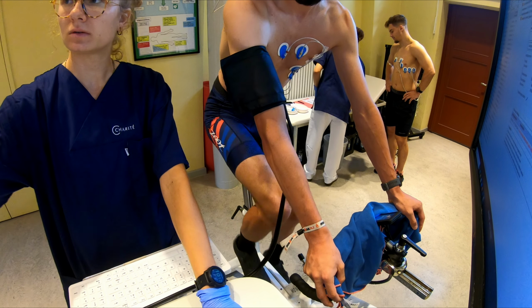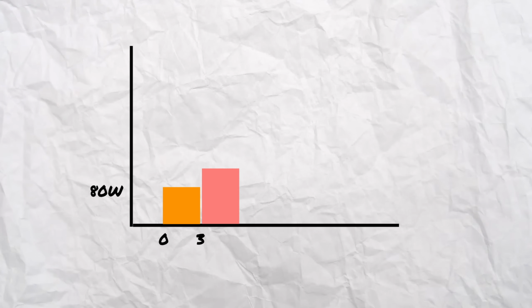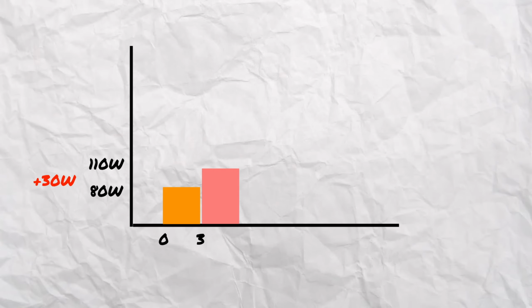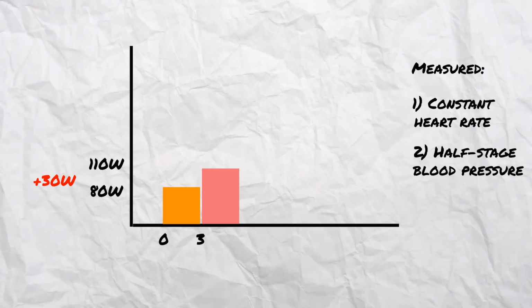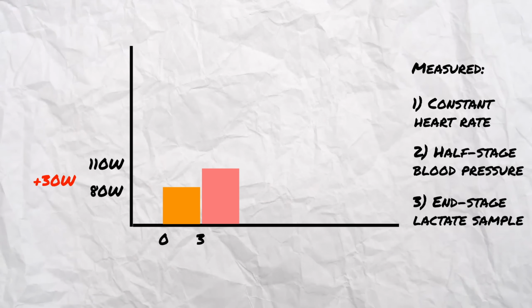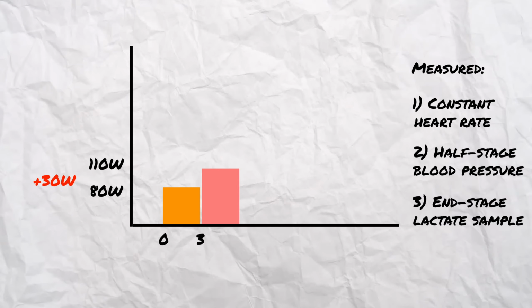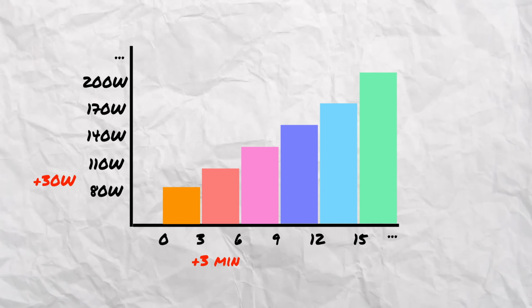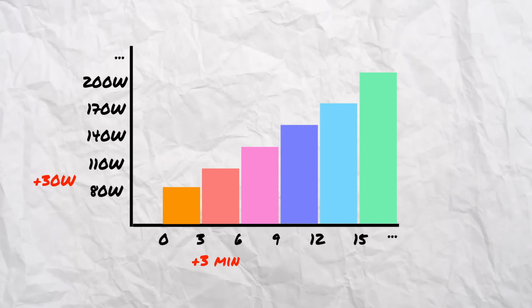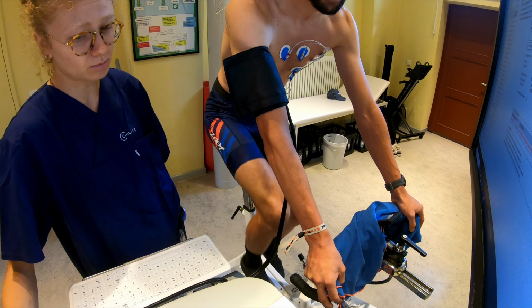This bicycle lactate threshold test starts at 80 watt, and each stage lasts 3 minutes. After 3 minutes, the intensity is increased by 30 watt. Heart rate is monitored at all times. Blood pressure is measured at half the time of each 30 watt stage, and lactate blood sampling is done at the last 30 seconds of each 30 watt stage. The intensity keeps increasing until you stop or the cadence gets below 70 RPM. Okay, so it's up to you how long you can push.